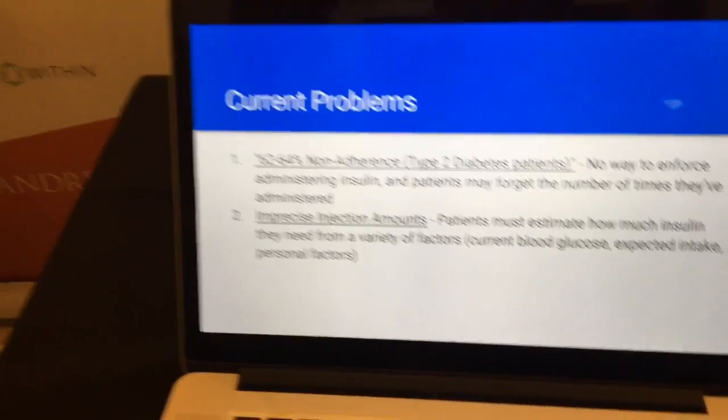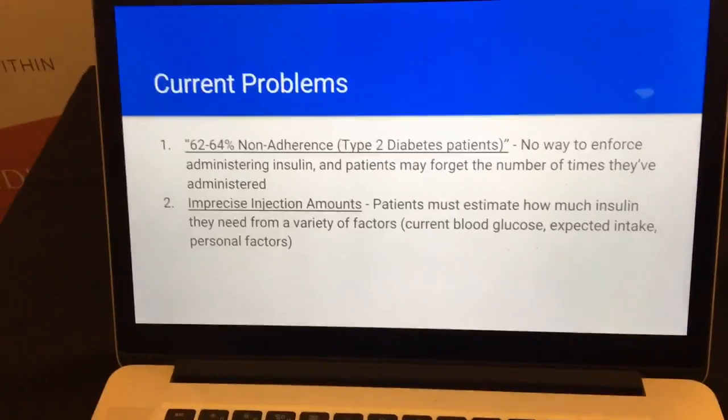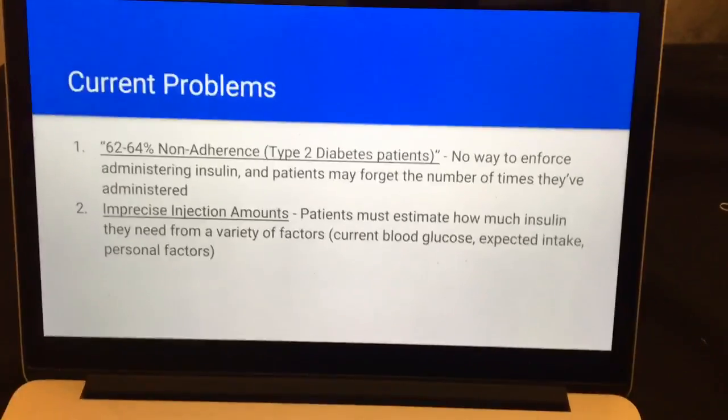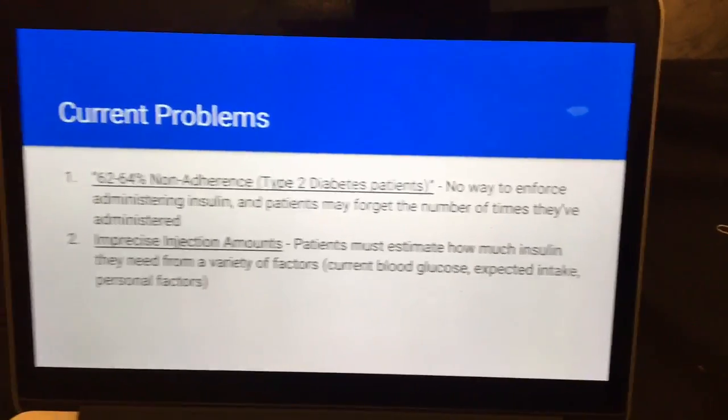And the way that diabetic patients currently do that is that they think about what they're eating right now, how many carbohydrates are in what they're eating. They think about when they last took insulin, and they think about what their current blood glucose is. But this is not automated, and they do this completely just by thinking and estimating. And so these were the two problems that we tried to solve.